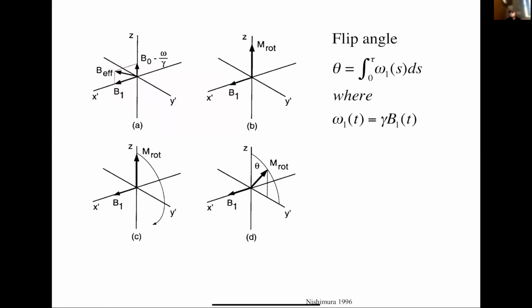So that we end up with our first equation that we're going to play around with a little bit, which is to define a flip angle. Flip angle is one of those key parameters. To prescribe an MR exam, there are probably about 5 to 10 really key parameters we need to think about, and one of those is flip angle. This is the first parameter we're introducing you to. Flip angle is essentially the angle that you move the magnetization away, so this would be flip angle 0, 90, 180, and so on.